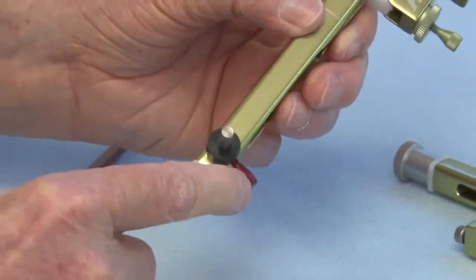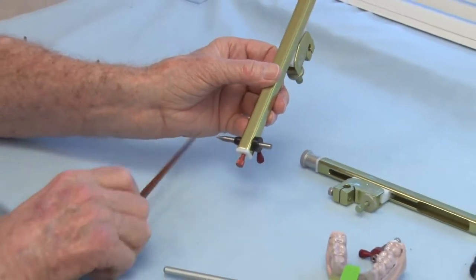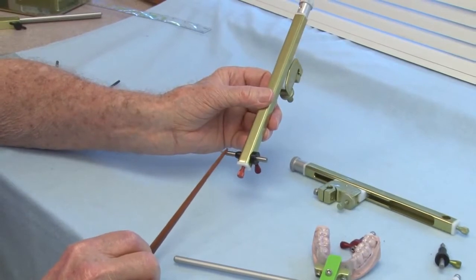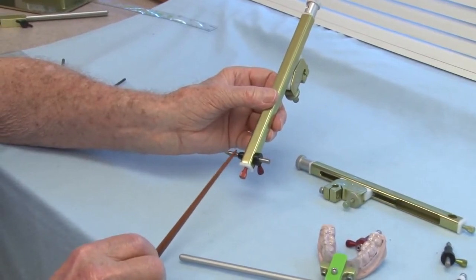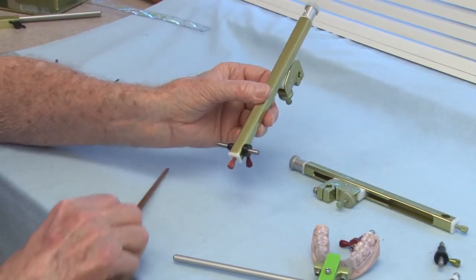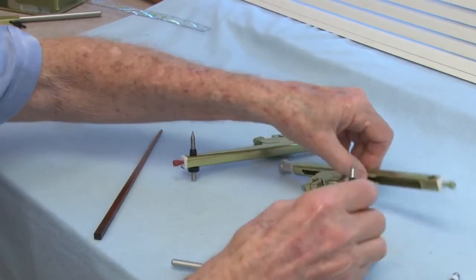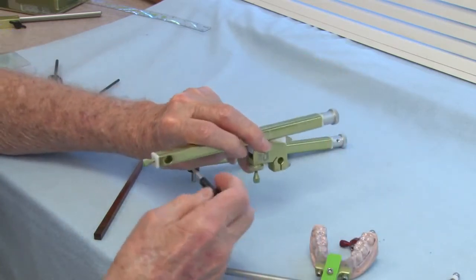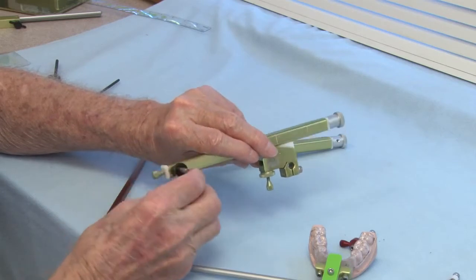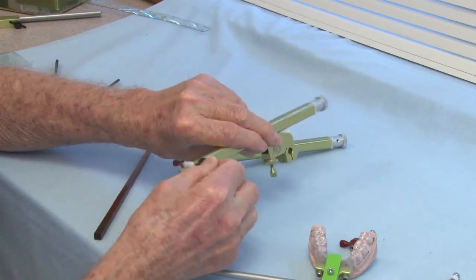And again, right side, right side. It has millimeter marks on it, and those marks will be used later on to measure the immediate side shift. The point goes in toward the patient, and if we set up the left side to be the same way, green and green all the way, and lock it in position so that it doesn't move in or out.